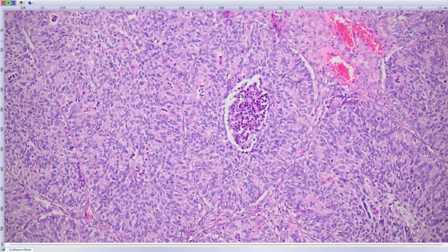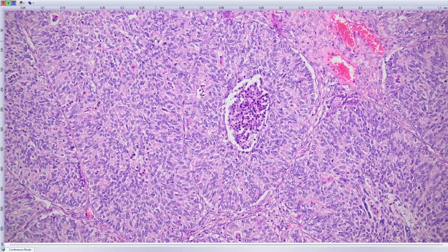And it was found out that this kind of morphology is very typically associated with underlying BRCA2 germline mutation, which was also the case in this patient. So this morphology of ovarian tumor, solid endometrioid transitional, can be used as a morphological indicator of underlying germline BRCA mutation syndrome. Important for treatment of the patient. Yeah, it's a mistake to miss it.